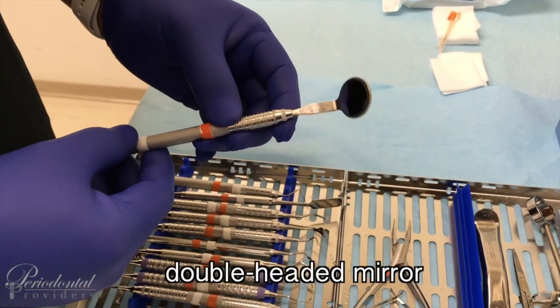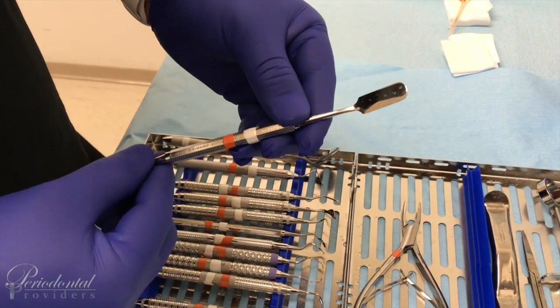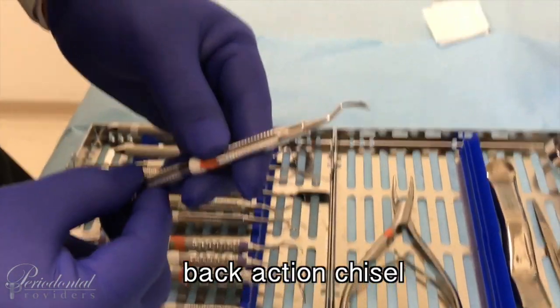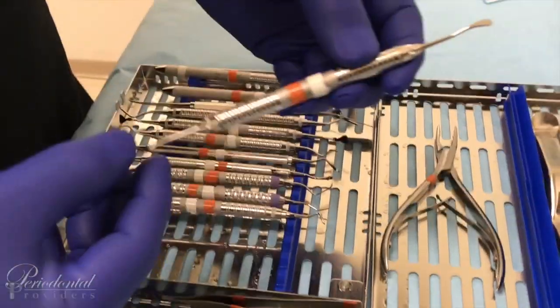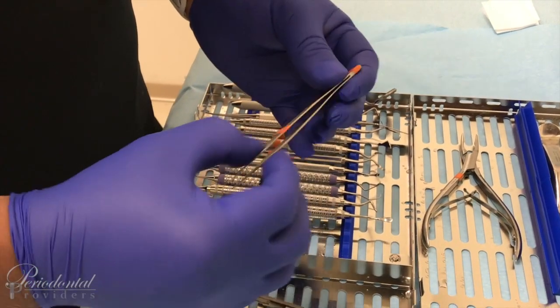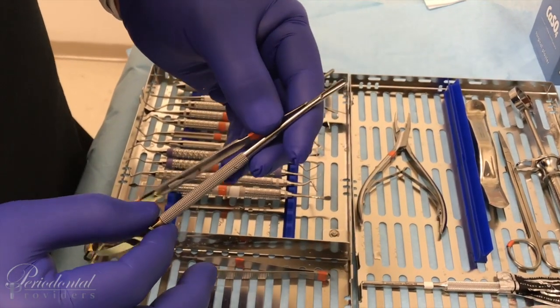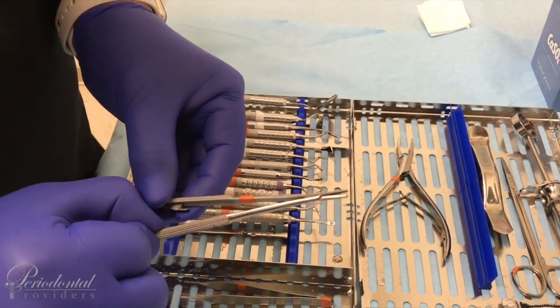Quick introduction to our instrumentation: a double-headed mirror, our probe, our Pritchard retractor, Pritchard curette, our Kirkland, our Orban knife, our curette, back action chisel, two Gracies, Sugarman file utilized for crown lengthening or anything interproximal, and our Orban knife, our Boozer elevator, tissue forceps — do not get these confused with cotton pliers. Castro Viejos, not to be used for any blade placement. Castro Viejos are utilized with a small size needle, usually a 4-0, 5-0, 6-0, and a 7-0. These are very delicate and should always be left open during the sterilization process.